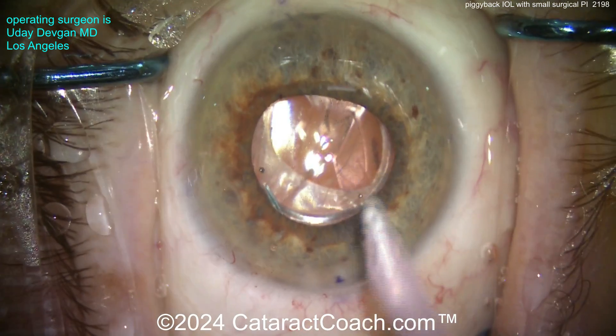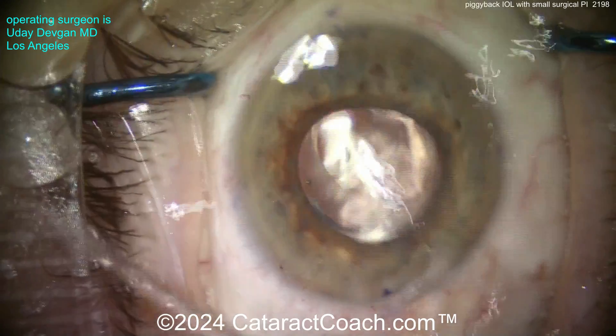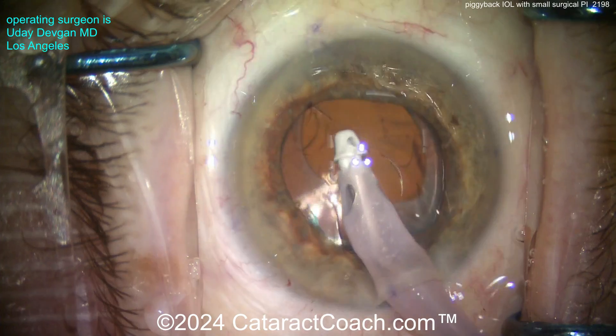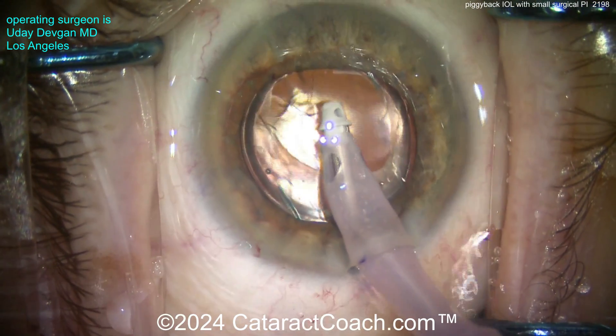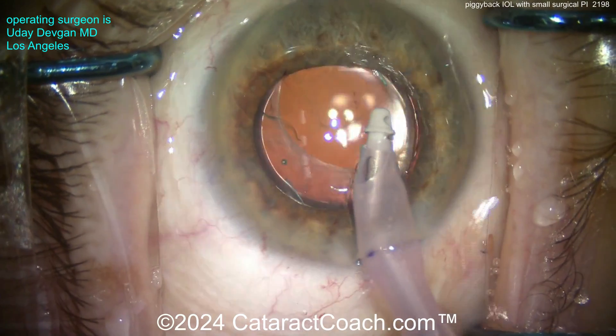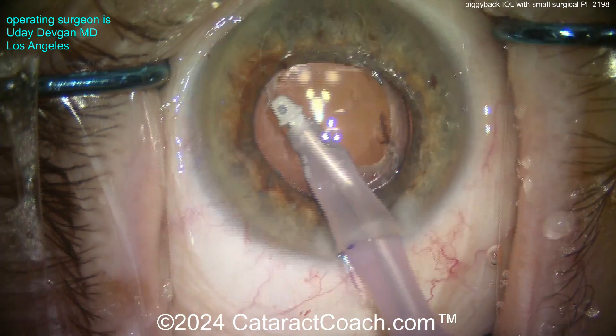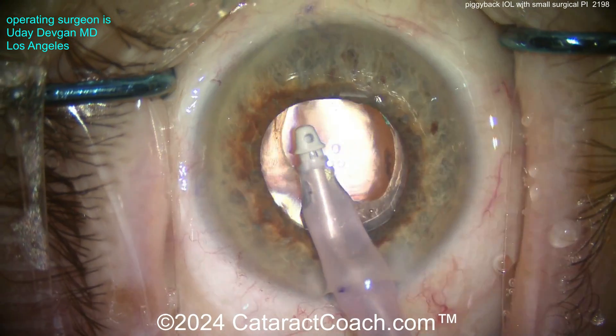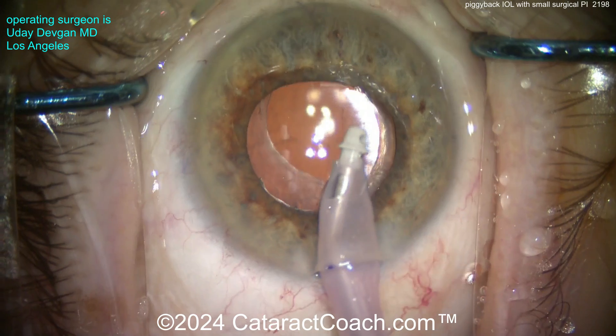Now let's remove the viscoelastic. Remember the mathematics for piggyback lens power: for plus power in general, it's about 1.5 times the refraction from the spectacle plane. So if the patient needed plus two diopters at the spectacle plane, you'd put in 1.5 times that — a three-diopter piggyback lens. And there you go, looking pretty good.